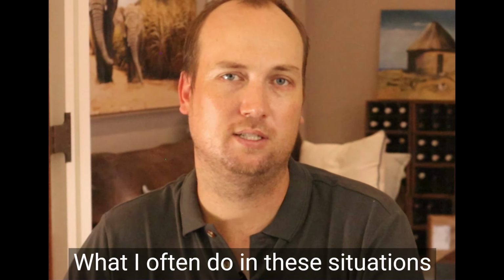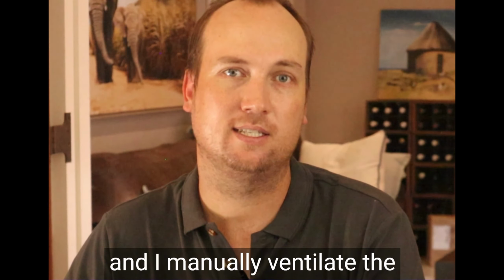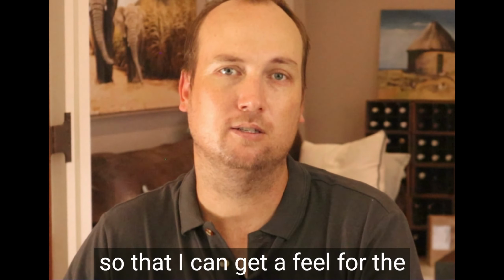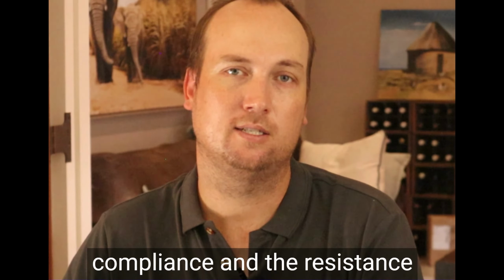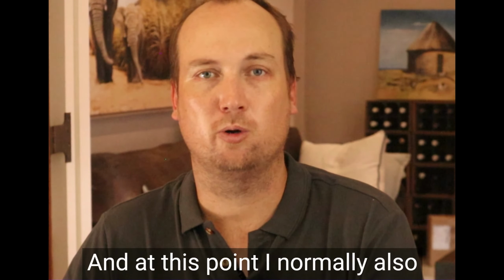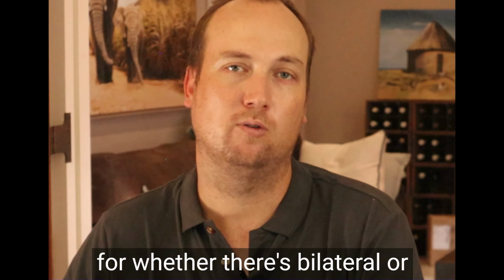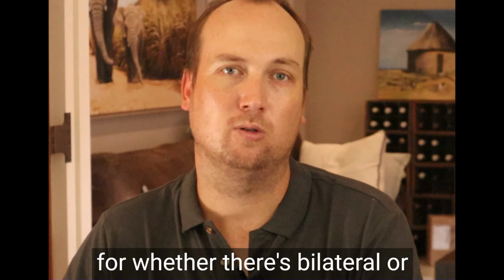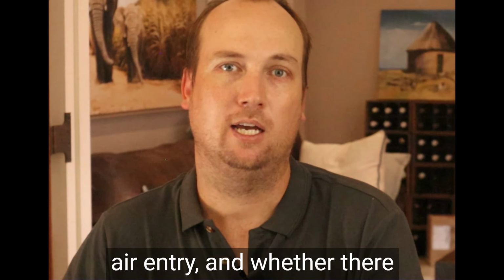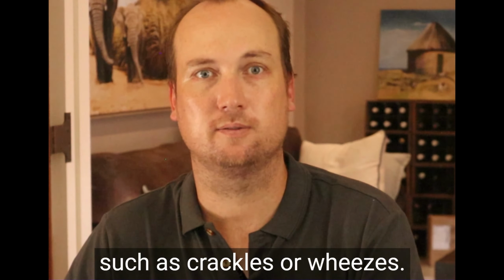What I often do in these situations is I switch off the ventilator and I manually ventilate the patient using the reservoir bag so that I can get a feel for the compliance and the resistance of the breathing system. And at this point, I normally also auscultate the chest to listen for whether there's bilateral or unilateral air entry, the quality of the air entry, and whether there are any additional sounds such as crackles or wheezes.